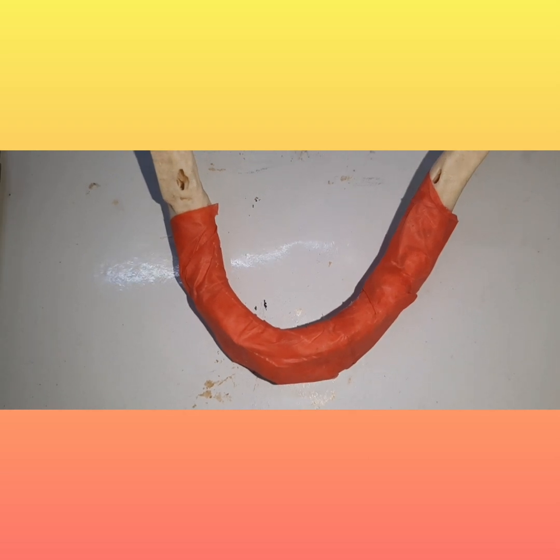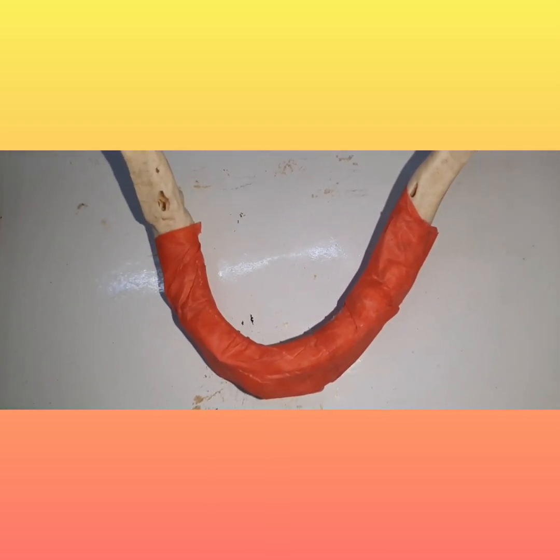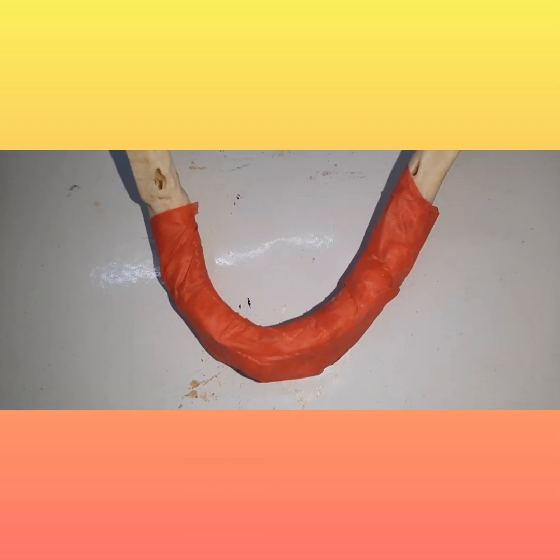So you have an edentulous patient or partially edentulous patient in which we are planning to place an implant. Now, of course, you will be taking your diagnostic model, diagnosing the patient, making a proper treatment plan, and investigating, taking OPG or CBCT of that patient in order to get the entire picture about the available bone height or bone width. And in this situation we have an edentulous model in which we are going to place only a single implant, just to show you all the steps which are involved in placement of implants.